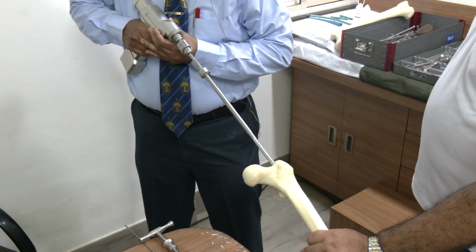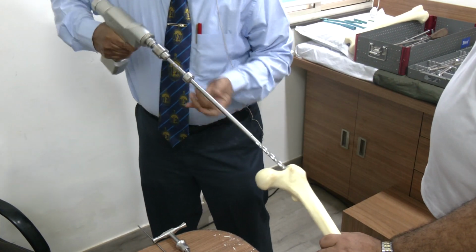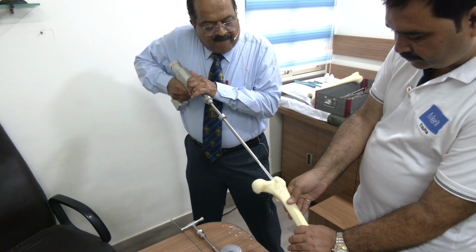In a live bone, this is not required. But as we are operating now, we are on a bone model, which is a strong bone.